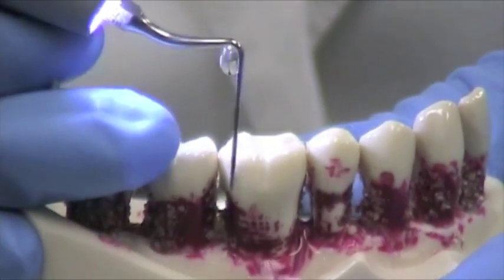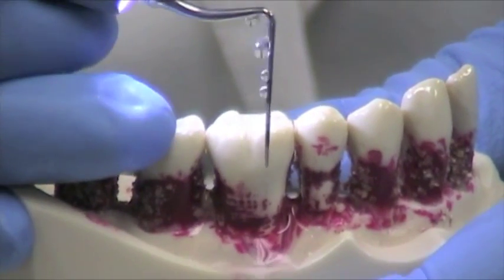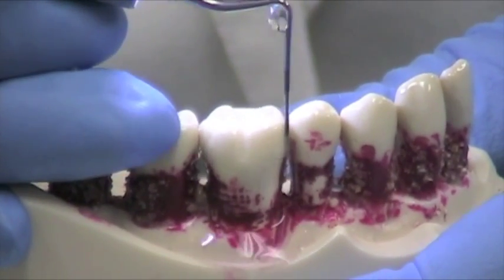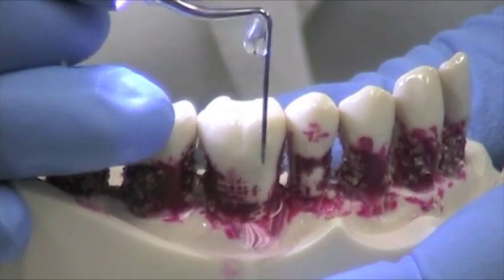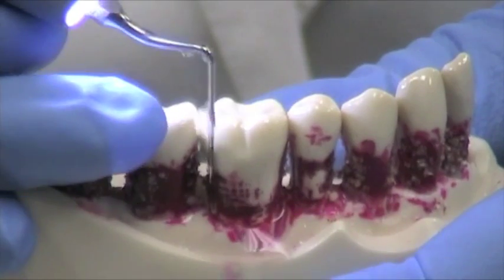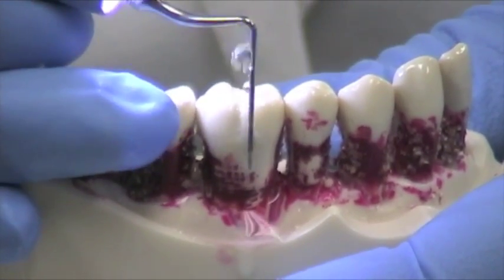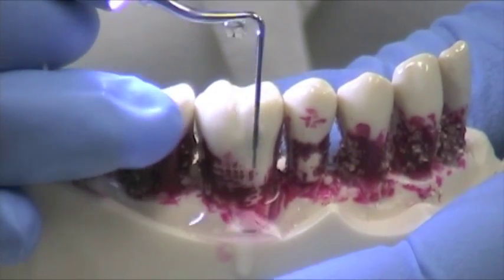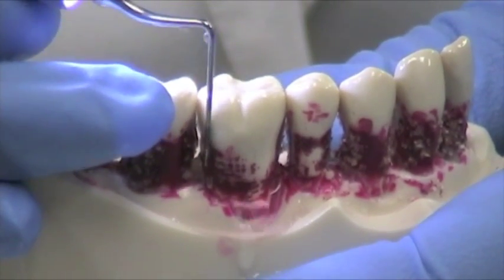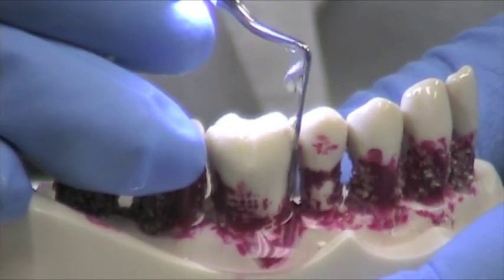You're really just doing biofilm disruption, not removing calculus. A lot of times when I'm training hygienists and they say the calculus isn't coming off, I'll say, what tip do you have? Oh, you have the wrong tip for that job. See the drop by drop irrigation, kind of just running along slowly and methodically, again going into the interproximal areas.